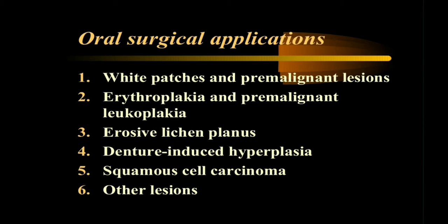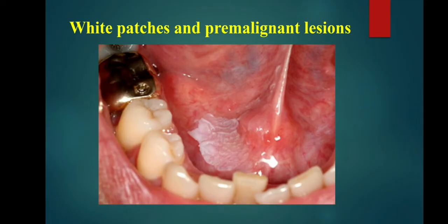Oral surgical applications of laser are as follows: white patches and pre-malignant lesions. Nutritional deficiencies such as iron or vitamin B12 should be treated. Patients must be strongly advised to give up smoking. If lesions don't respond and excision is required, the CO2 laser is a good option.